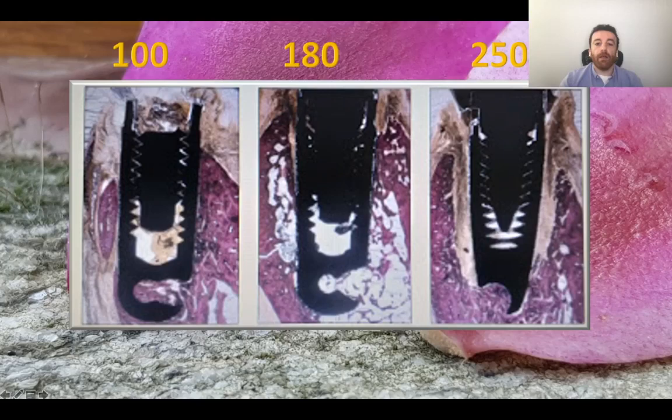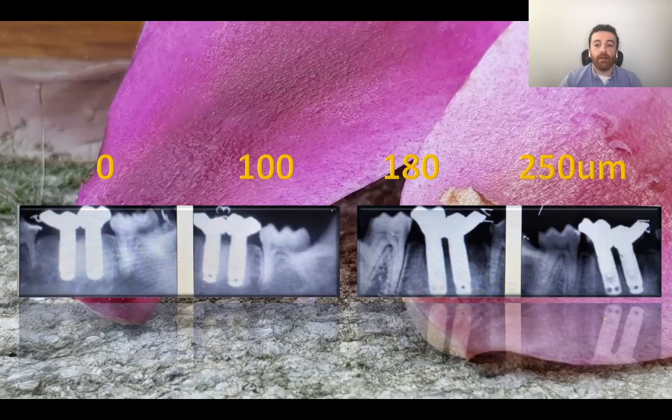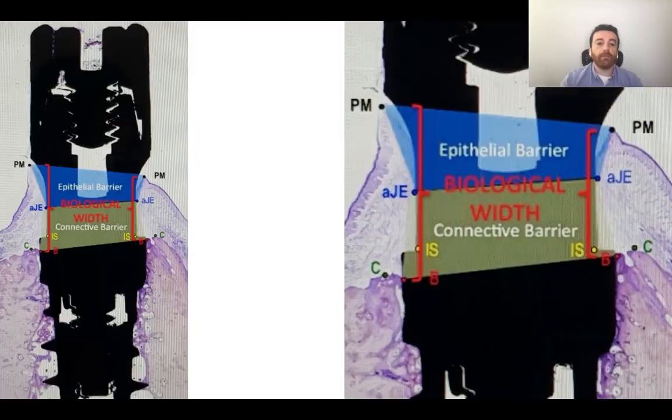And you can see here a histology demonstration showing an increase of the occlusal load on the implant, and over time you can see subsequent bone loss, or loss of support, around that dental implant. Again, demonstrating the same concept here as well.